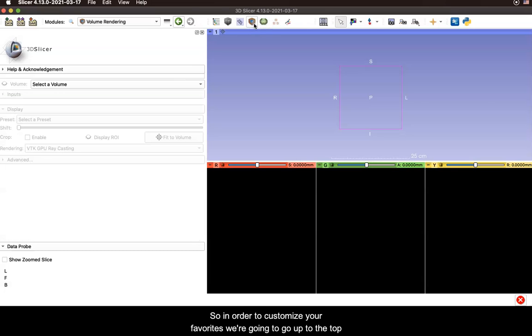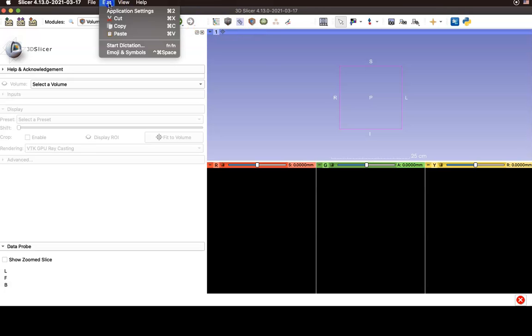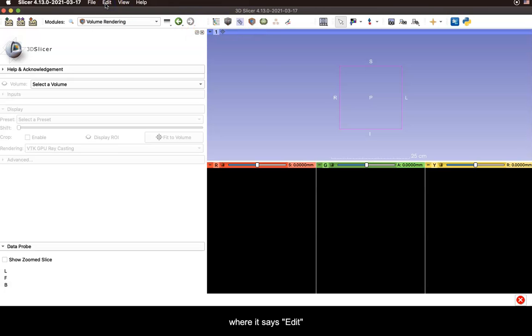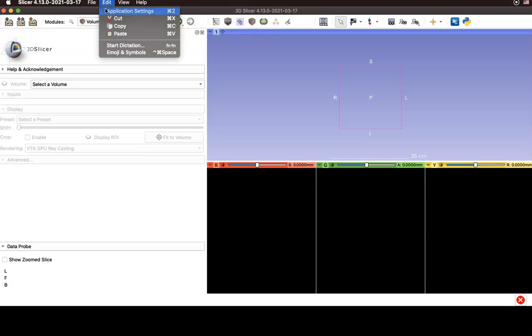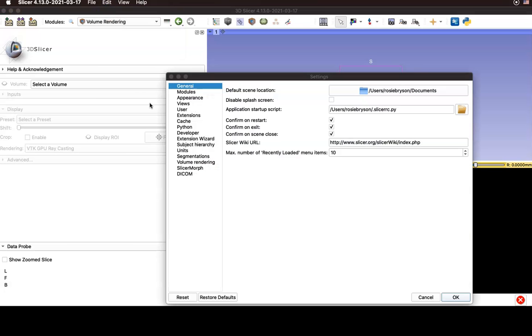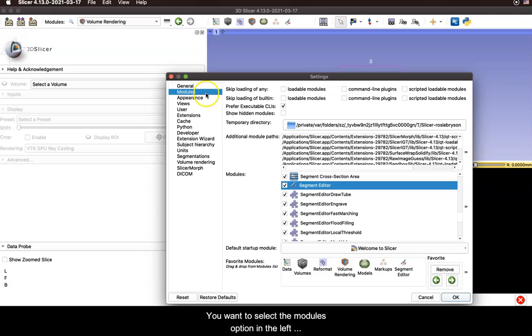So in order to customize your favorites we're going to go up to the top where it says edit and click on application settings. We want to select the modules option in our left hand window here.